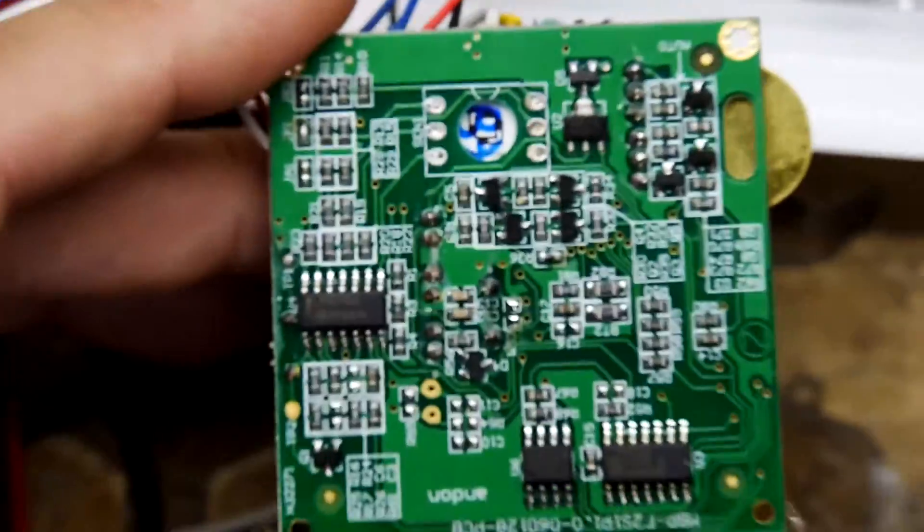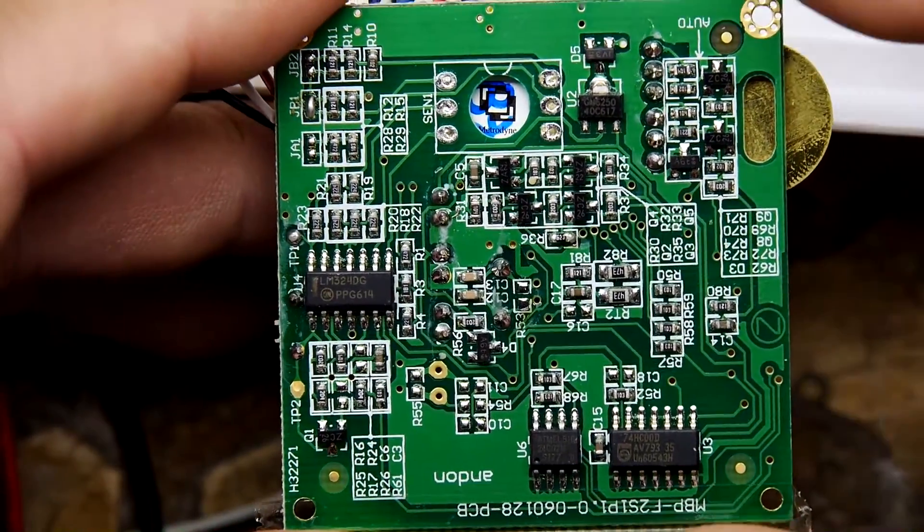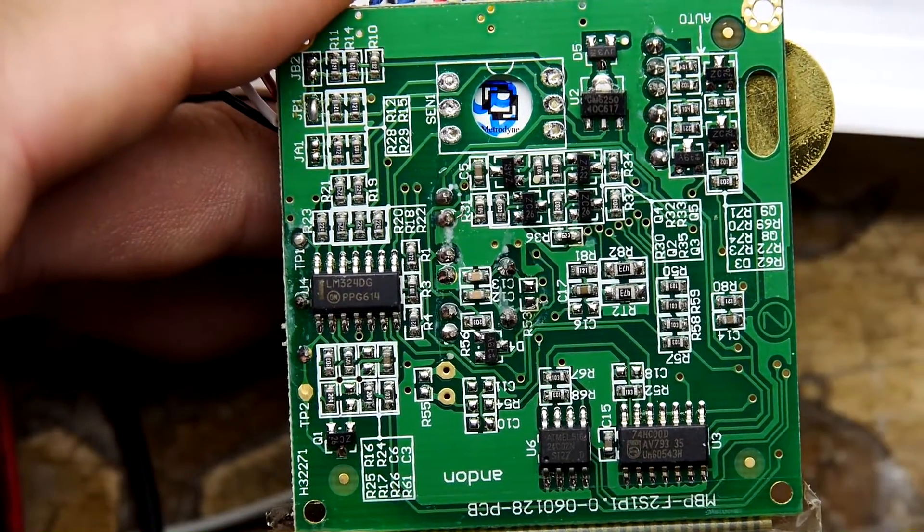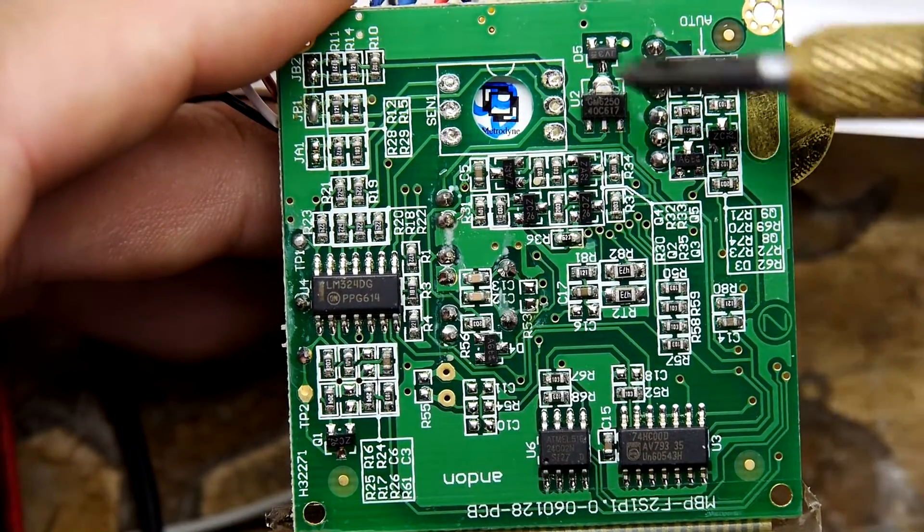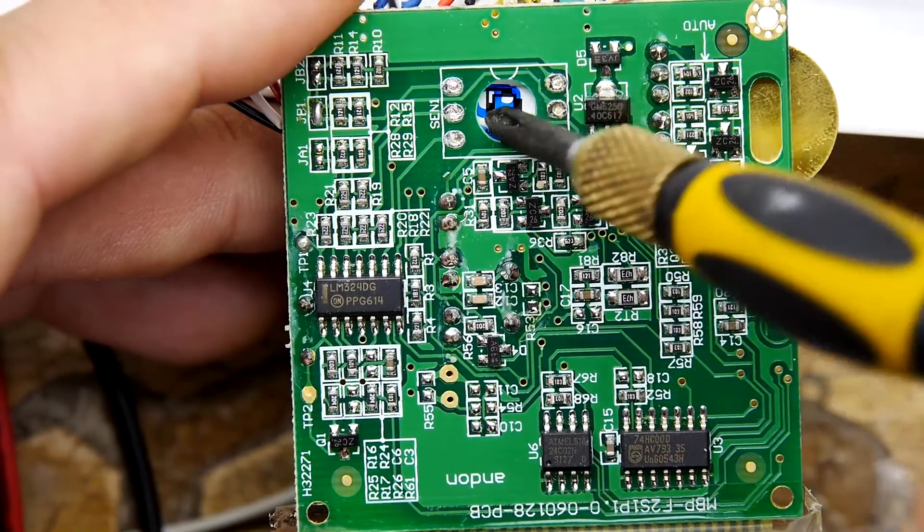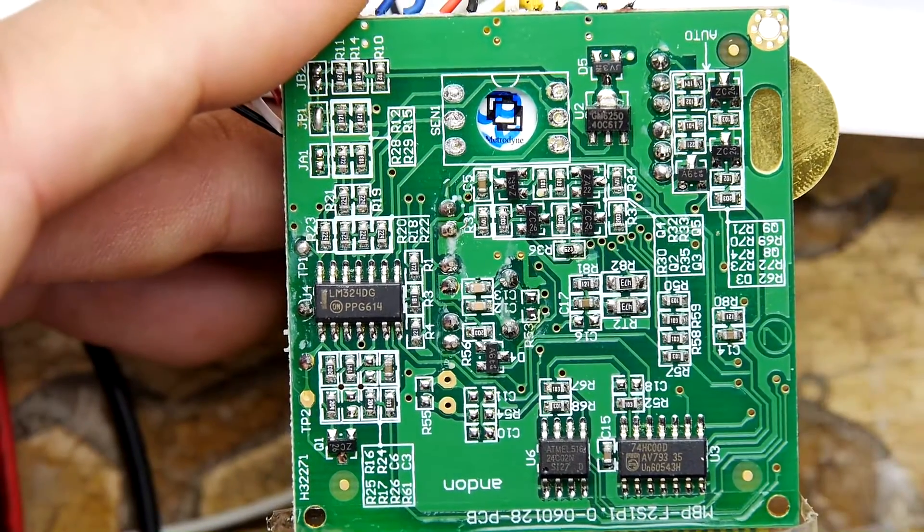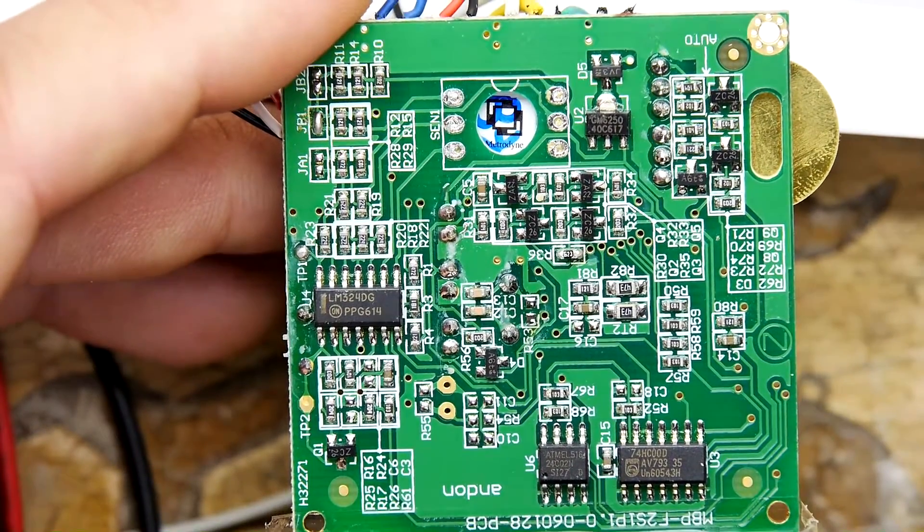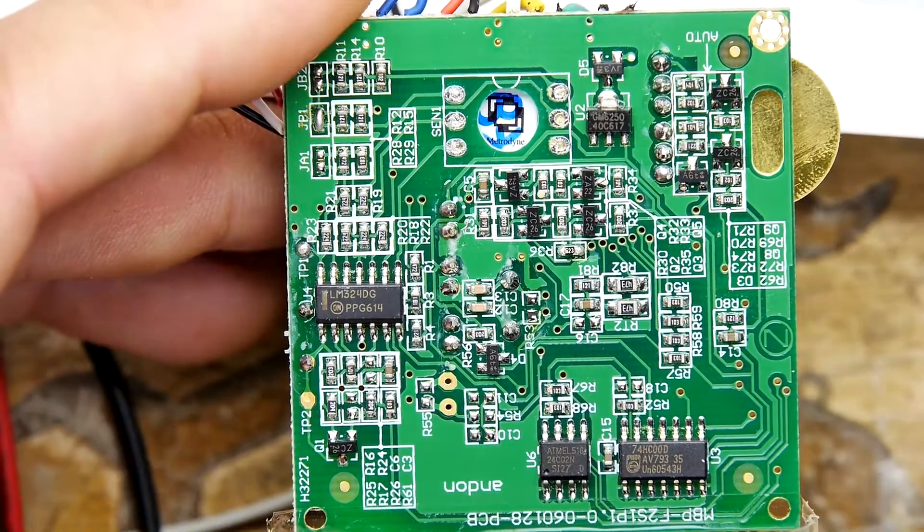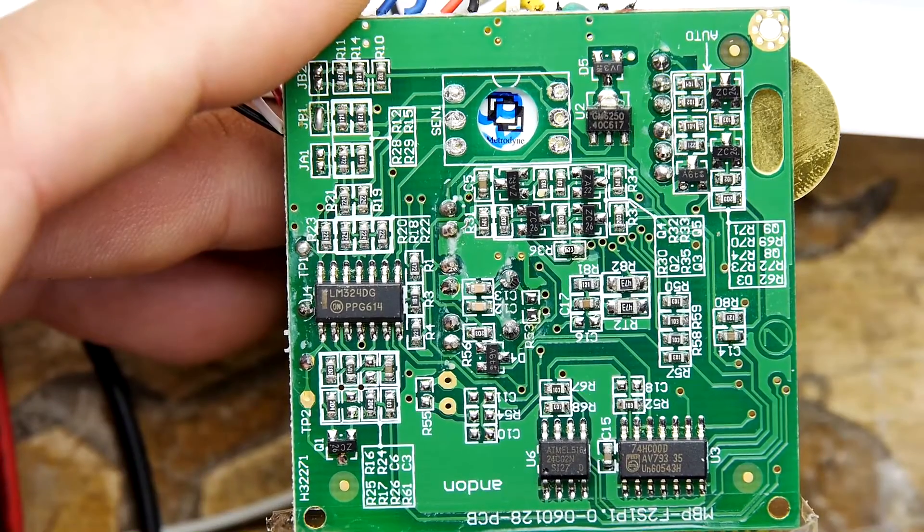It does give us an idea as well of what's on there. So let's zoom in. Boosh. I'll try to hold it steady. So that's the bottom of the pressure sensor, by the way. So you can see that there is a hole in the board. And that's to let the pressure through if necessary. So that's kind of fascinating.